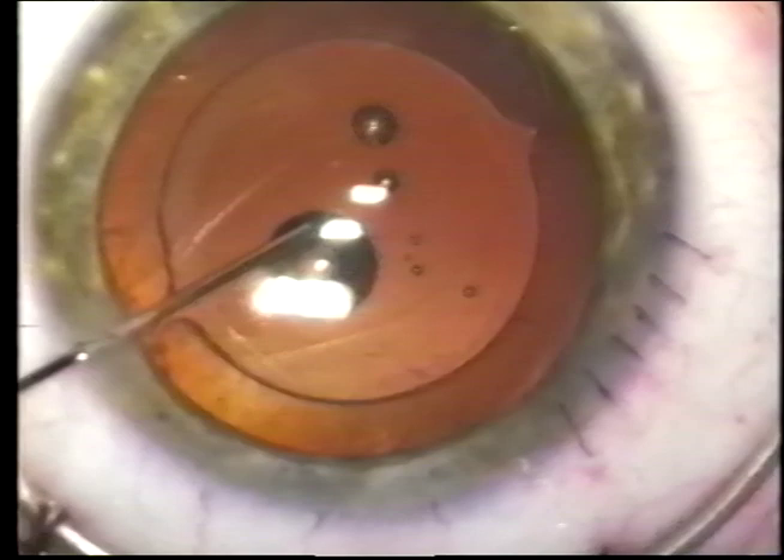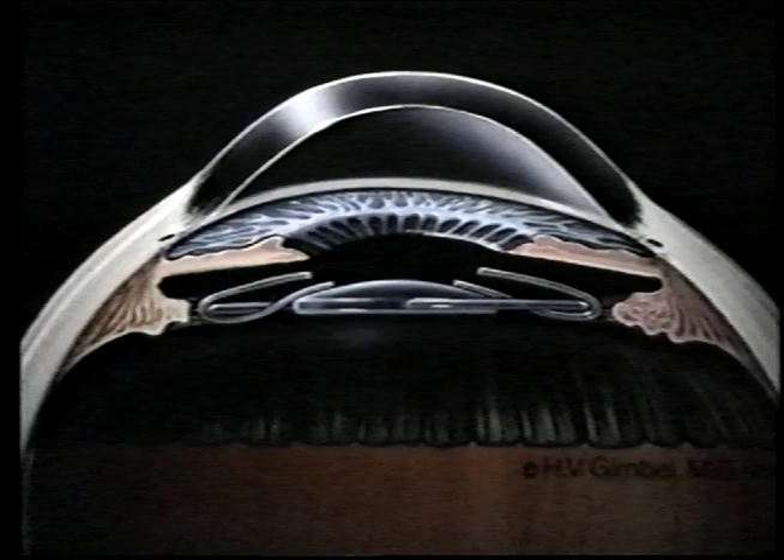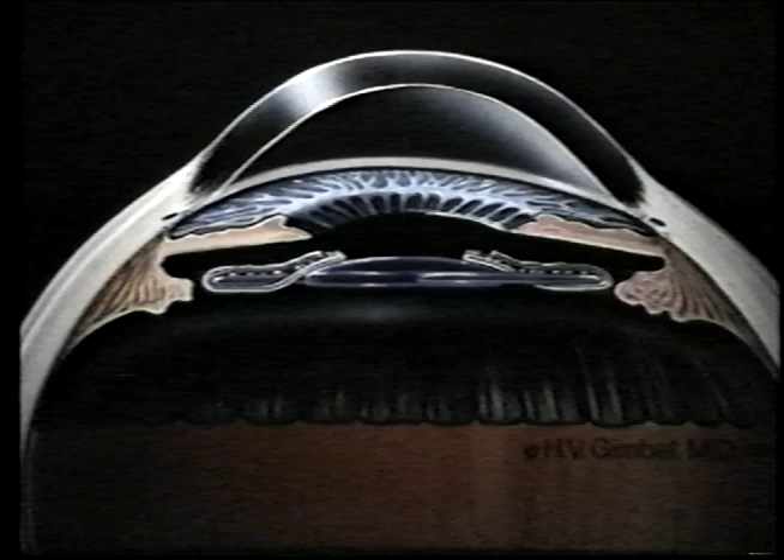Then the other side will be nudged as well, and you'll see an immediate stabilization once the lens pops into the posterior chamber and is grasped by this opening that is smaller than the optic. You will see that the posterior capsule opening is now oval, and the optic is posterior to the anterior capsule opening and posterior capsule opening, and we anticipate that the pearls will deposit anterior to the surface of the IOL. Certainly additional cases are needed to document safety and long-term efficacy before recommending the widespread application of this technique.